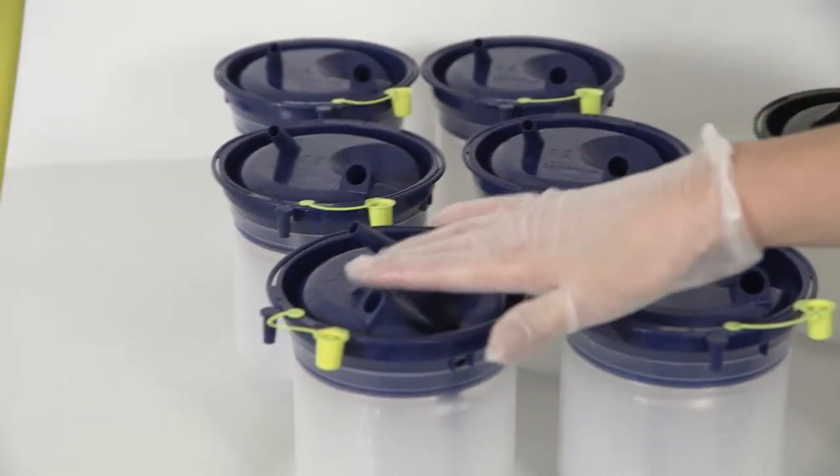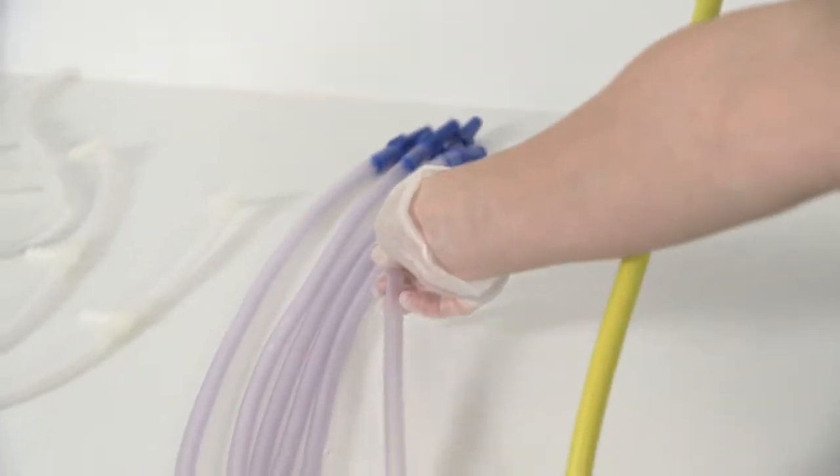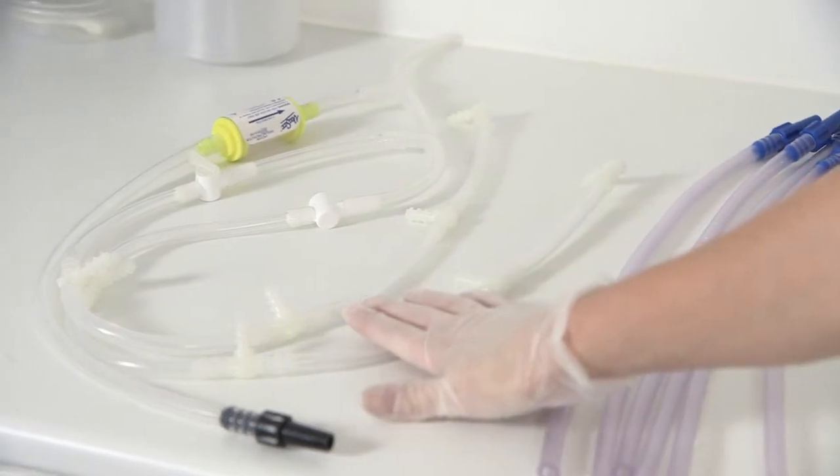You also need 6 cascade tubing sets and the re-usable cascade tubing kit for the 8 position cascade stand.